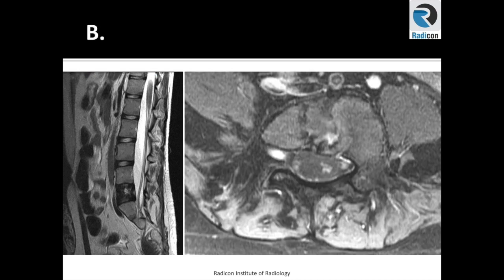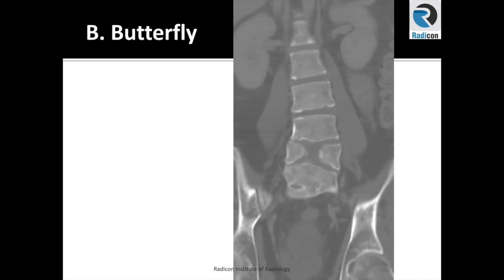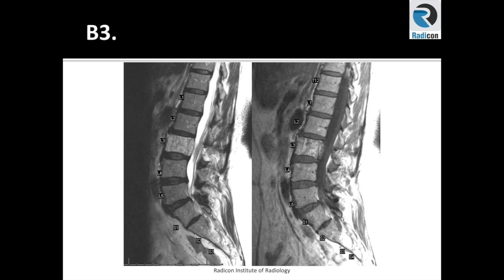In this patient, the abnormality was picked up on the sagittal slices, and axial images were taken which showed failure of fusion of the two halves of the vertebral body due to persistent notochordal tissue between them. A CT was performed which showed classic appearances of the butterfly vertebra.